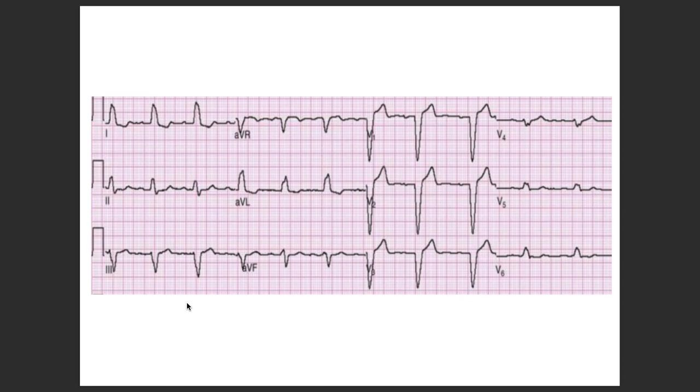Whenever you have to take some quick decisions, especially in the earlier times, you can use those tips and tricks. And always remember, tricks also have their limitations. They should be used only till the time you get those rules in your permanent memory.